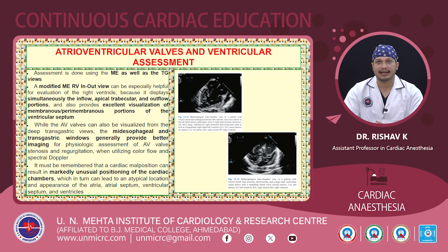With respect to the right side of the heart, a modified midesophageal right ventricular inflow-outflow view is especially helpful because it displays simultaneously the inflow, apical trabecular as well as the outflow portions, and also provides excellent visualization of the membranous and the perimembranous portions of the ventricular septum. While the AV valves can be visualized from deep transgastric views also, the midesophageal and the transgastric windows generally provide better imaging for the physiologic assessment of AV valve stenosis and regurgitation while utilizing color flow and spectral Doppler.